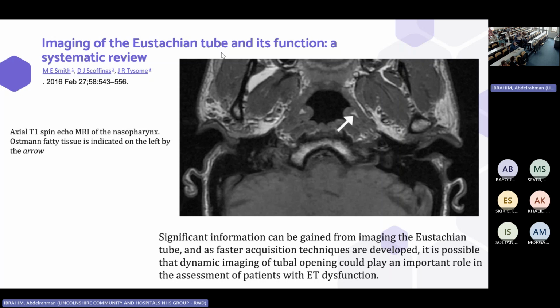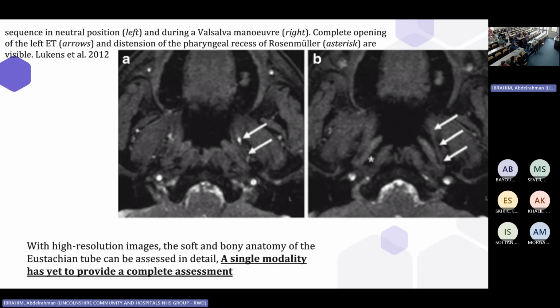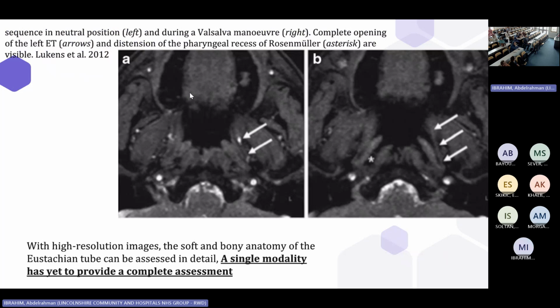MRI scan as well can give us good anatomical information regarding the Eustachian tube. We can see here a T1 axial cut of an MRI scan. This white triangle is the Ostmann fatty tissue. This is an MRI scan in the normal position, and we can see the fibrocartilaginous part of the Eustachian tube. This is the Ostmann fat. This is during the Valsalva maneuver, and I can see how the fibrocartilaginous part of the Eustachian tube is enlarged.